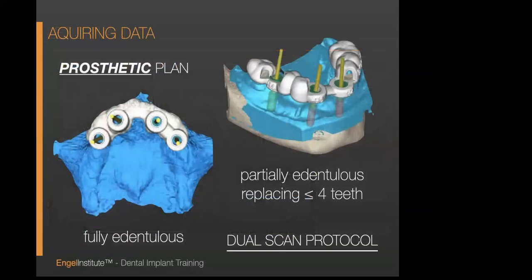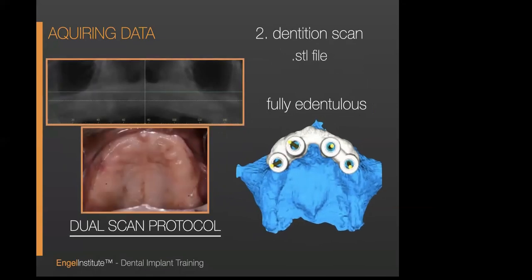Okay, so now that we've spoken about the under four implants, now let's talk about full arch. Okay, full arch. How do we get a guide to fit on that and have a surgery that's conducive for a patient's teeth when they don't have teeth? What do we do in the second guide?